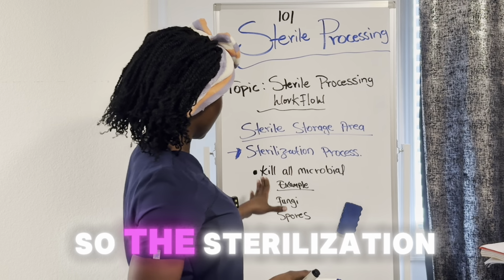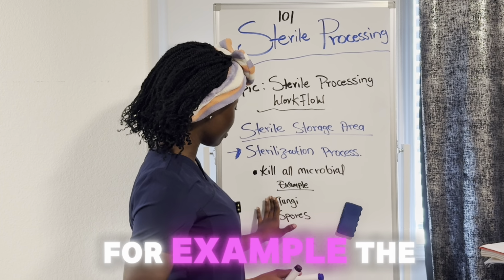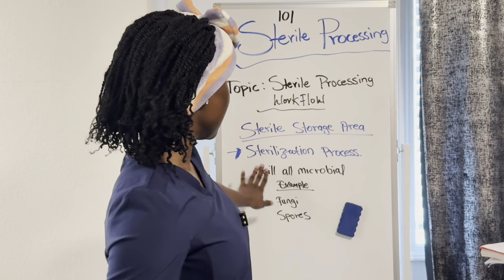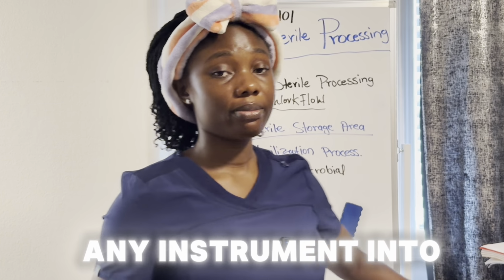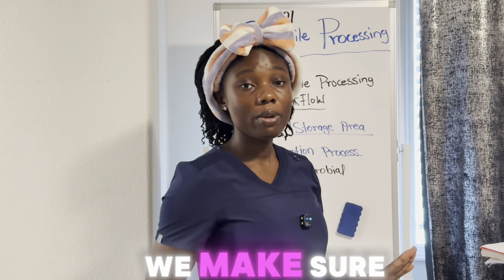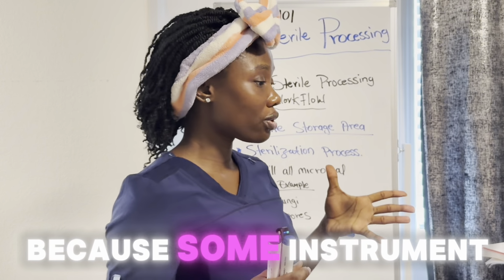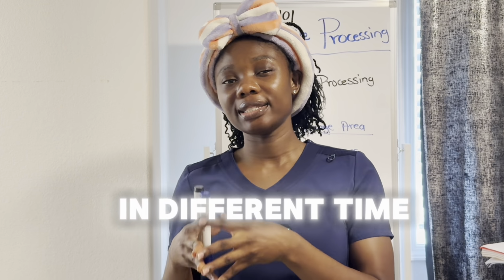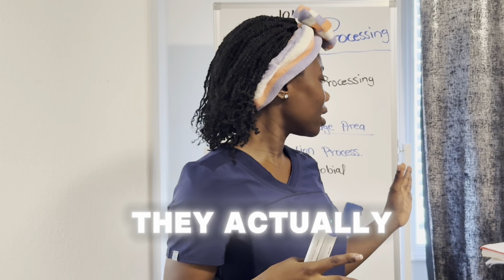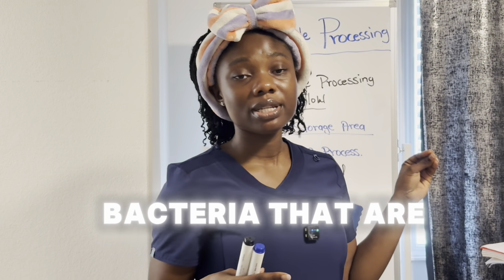So the sterilization process kills all microorganisms, for example, the fungi and the spores. Before we process any instrument in the sterilizer, we make sure we follow the instrument IFU, because some instruments have different temperatures and different times they have to go through before they actually kill all the bacteria on them.